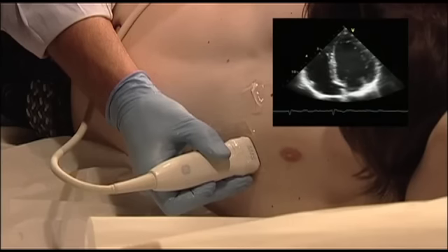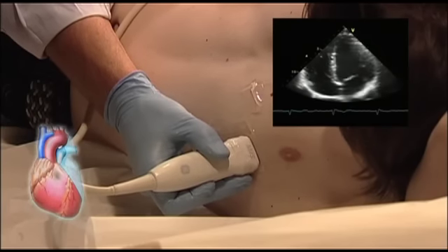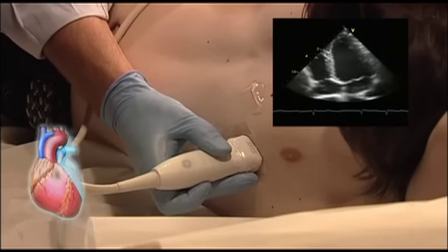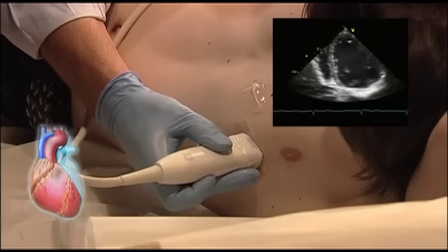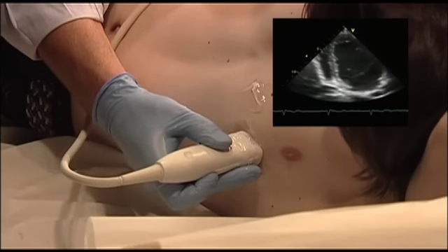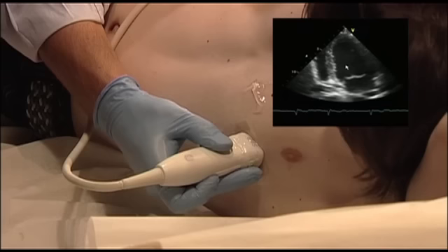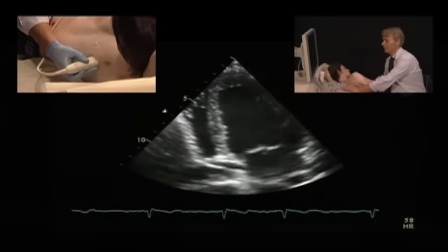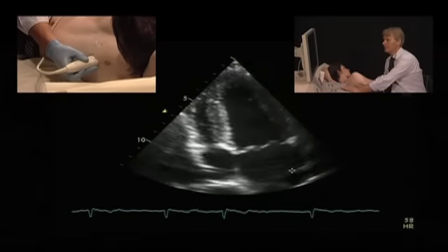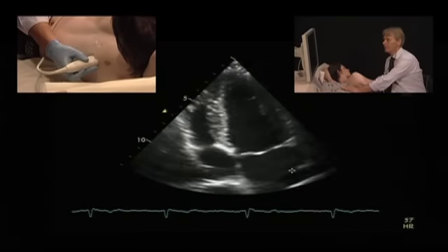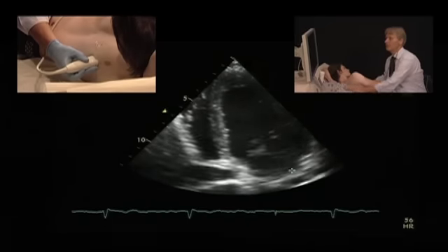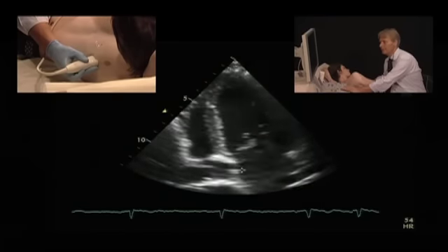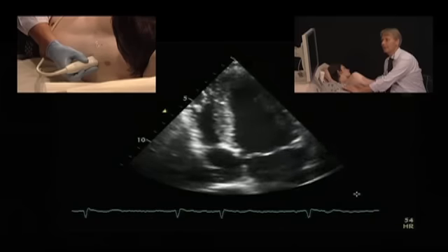Now we have the ventricle in the middle. And now I will be rotating without changing the axis slowly counterclockwise. You will see that the right ventricle gets smaller and smaller. And at the same time, you will have to try to assure that the size of the left atrium remains as large as possible. If you lose the size, you will also tilt out of your axis and you will not get a decent two-chamber view. So this is basically just to give you an aid that you are still on track.